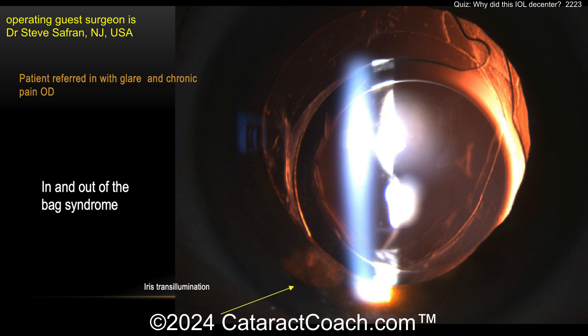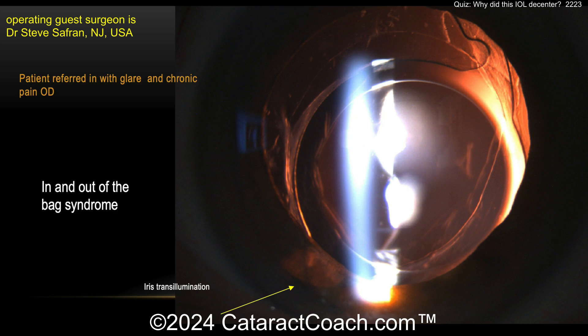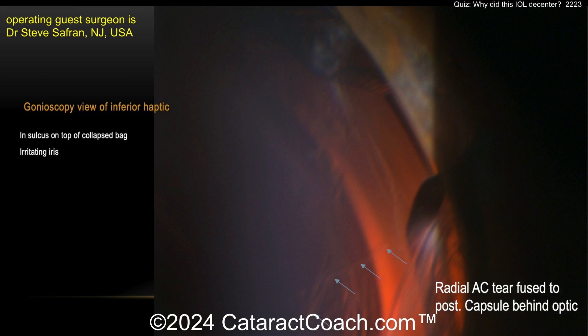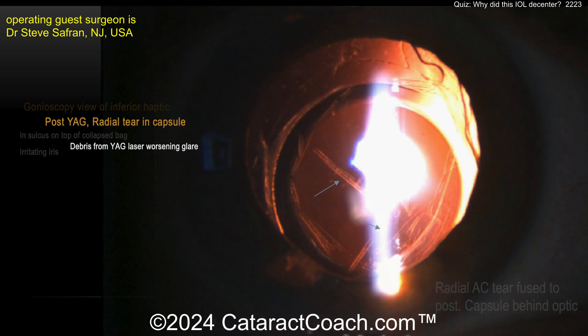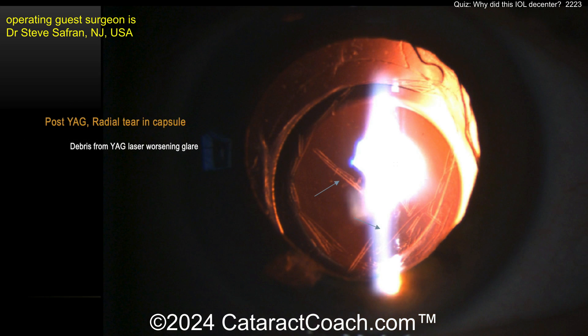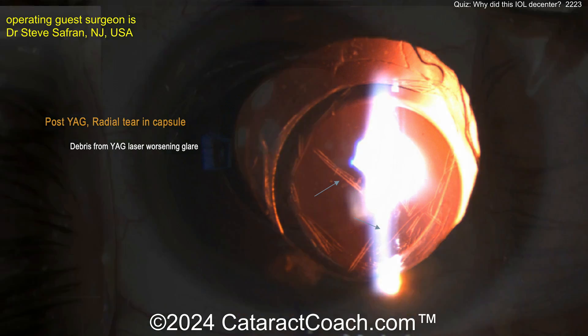You can see the inferior transillumination defect where that outside haptic is scraping the back of the iris, causing glare and chronic pain. Looking at the inferior angle, there's a radial anterior capsule tear fused to the posterior capsule behind the optic — that's the problem.